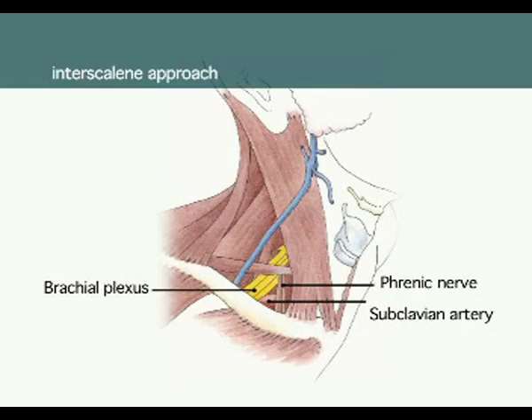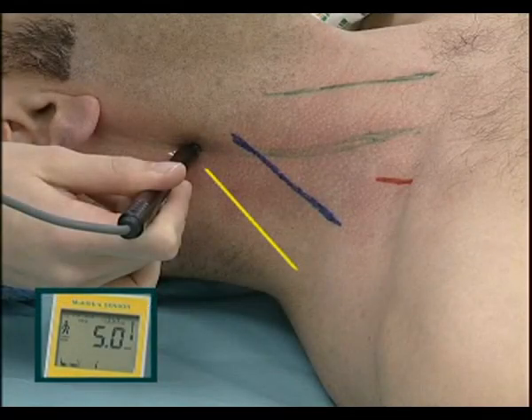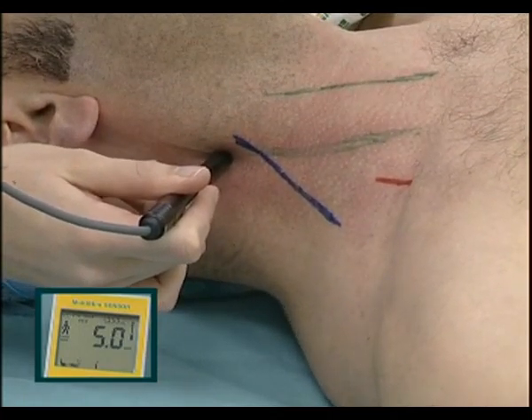Paresthesia is usually local. The first motor response elicited is from stimulation of the superficial cervical plexus and the spinal accessory nerve, which lie in close association. We can see twitching of the trapezius muscle.